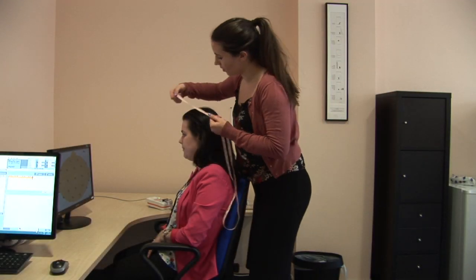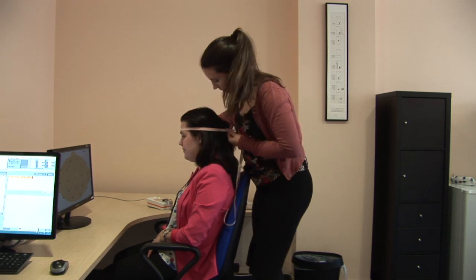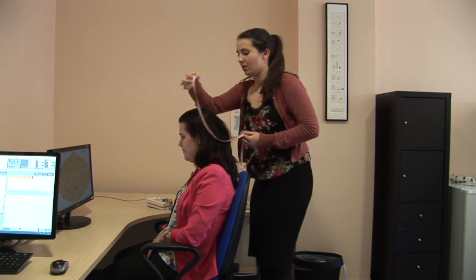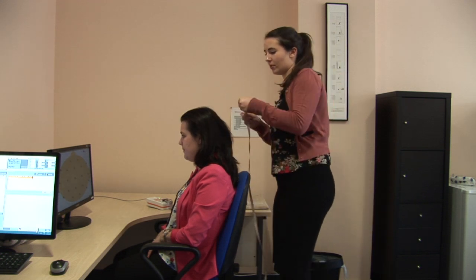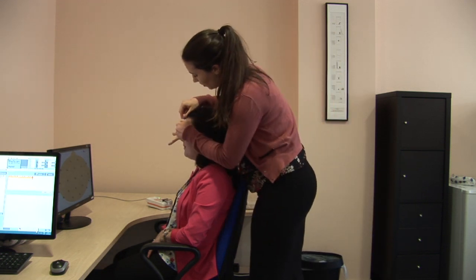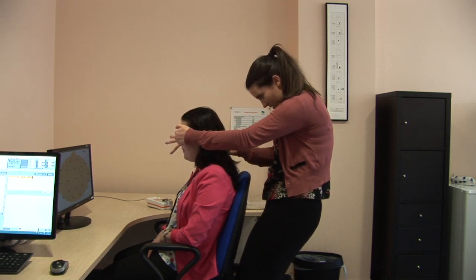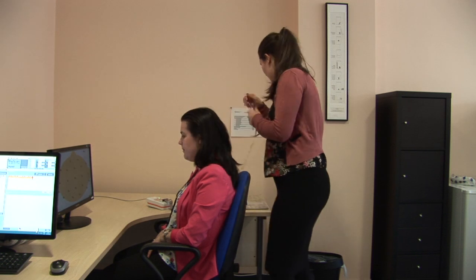Okay, so first thing I'm going to do now is just to measure around the outside of your head, and that's going to help me decide what cap we're going to put on. And then the second thing, I'm going to measure from the front to the back, and that's going to give us the opportunity to make sure that the cap is in the right place. Okay, that's perfect now.